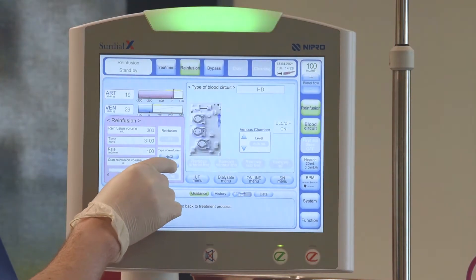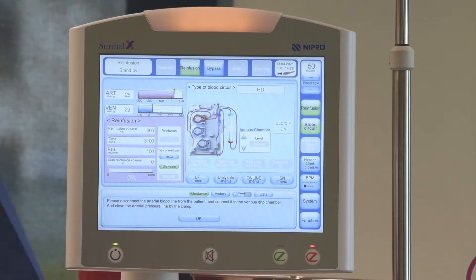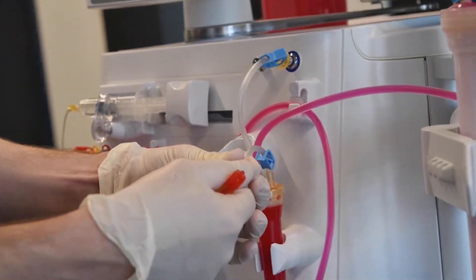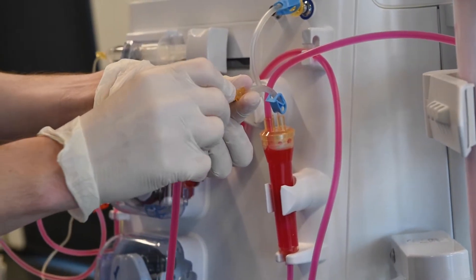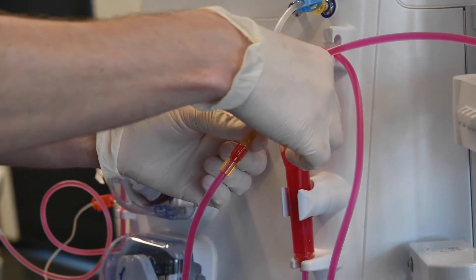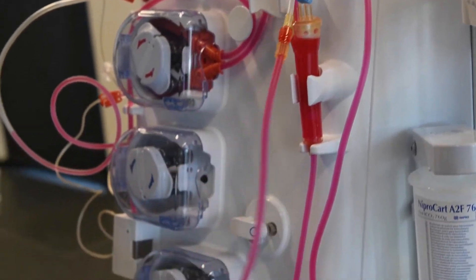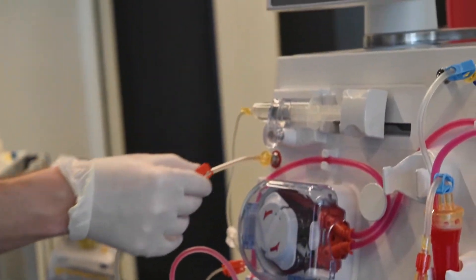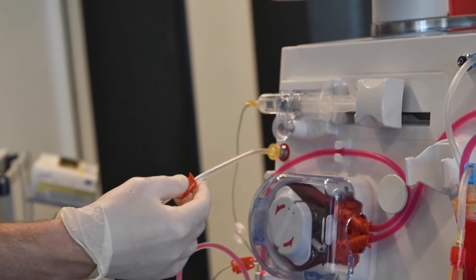For Diff Reinfusion, select Dialysate from the pink reinfusion menu. Disconnect the arterial line from the patient and attach it to the venous drip chamber. Then open the clamps on the drip chamber and the arterial line. Close the clamp on the arterial pressure line. CERDUALX user guidance will walk you through these steps as well.